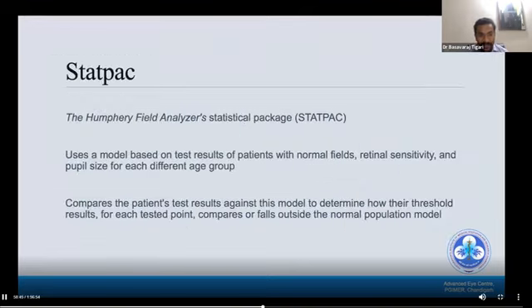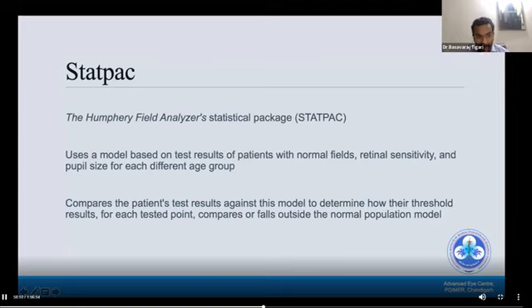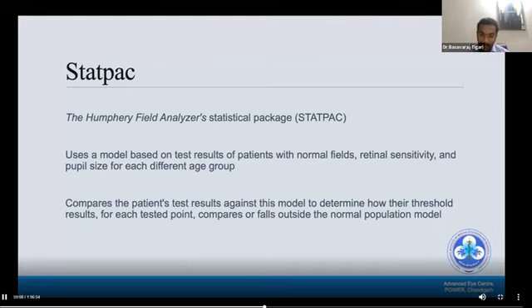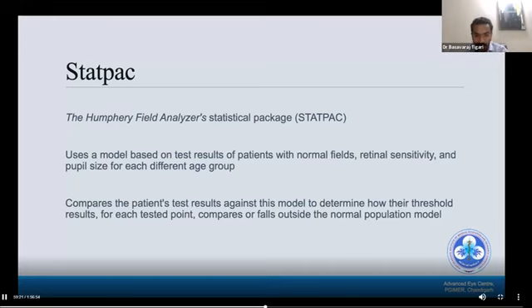STATPAC — we commonly use the Humphrey's Field Analyzer statistical package. This model determines how the results for each tested point compare against the normal population. Basically, it compares the normative data with the present patient, matched for age, against the normal data.